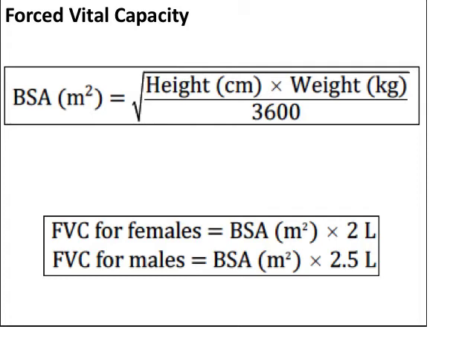In order to obtain a full lung volume, the residual volume also has to be taken into account. Now, you can't blow out your residual volume or else your entire airway would collapse. So what you do is you convert the units of the FVC estimate from the data collected from milliliters to liters by, again, dividing the number of milliliters by 1,000, just like we did for tidal volume.